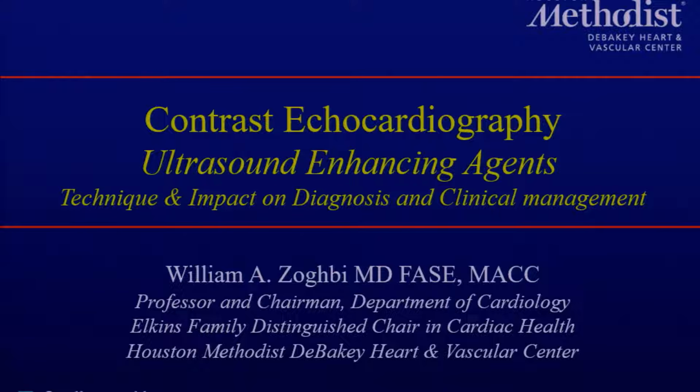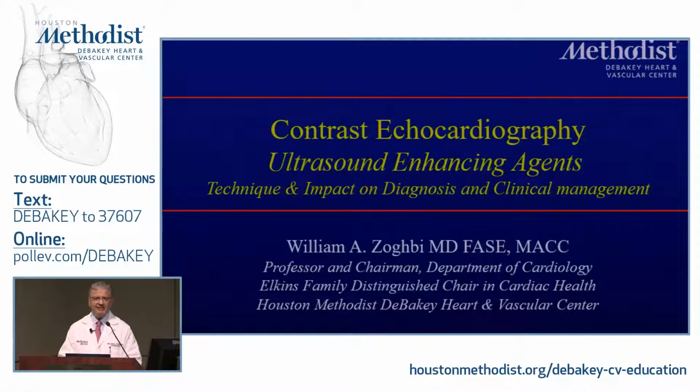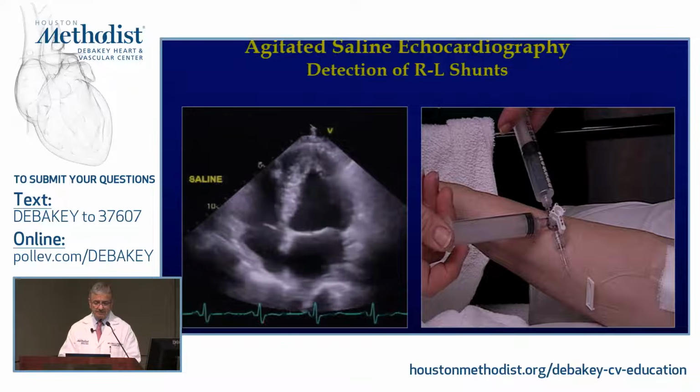So this is unique for echo, because most of the time when we use contrast agents, the contrast per se is not affected as much by the imaging technology, be it CT or MRI. So I think it's important to take a look at the details.